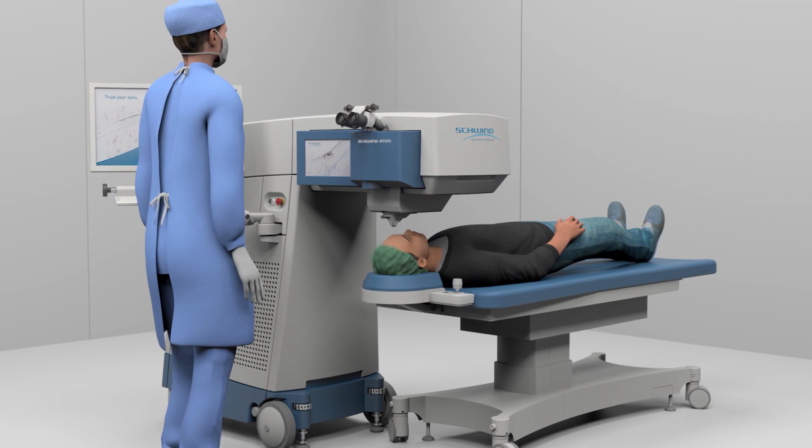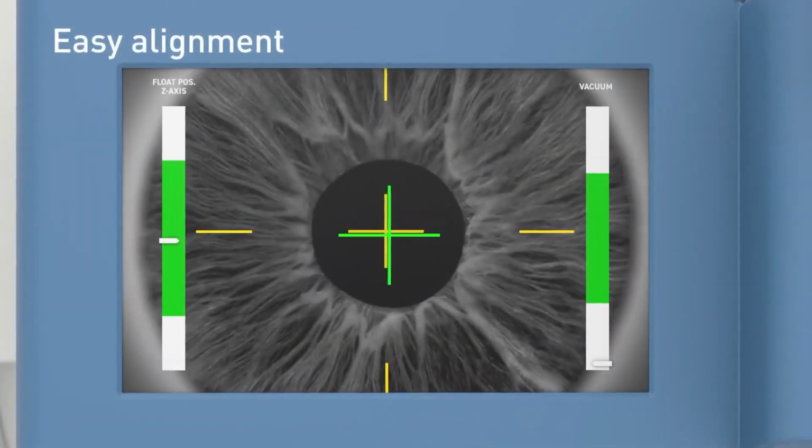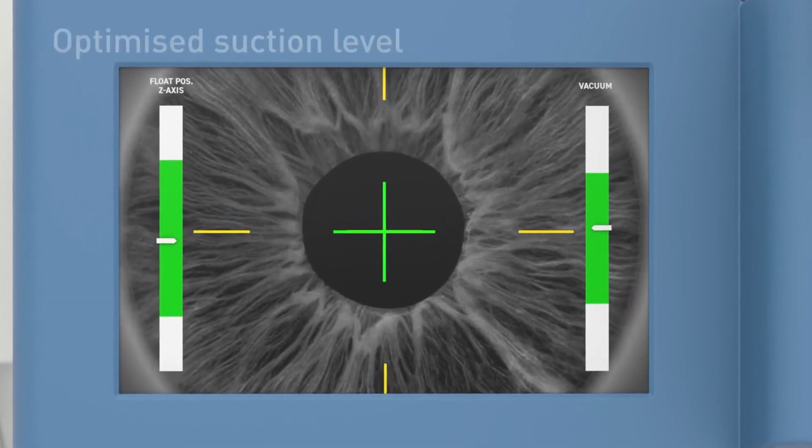And as the laser starts to come into position, I warn them the green light's going to move, don't follow it. And then if they're not in a perfect position, there are very easy alignment parameters that you see on the screen with the ATOS, and you can ask them to make small movements of their eyes. I've had patients where it's clear that they are moving their eyes underneath because they're nervous or whatever, and it doesn't necessarily lose suction.